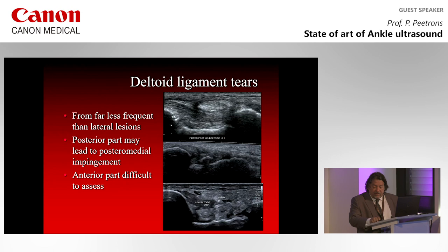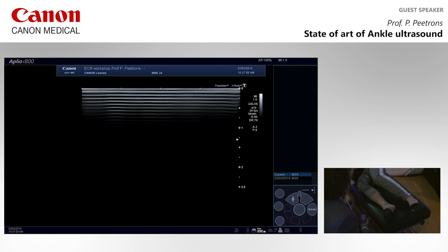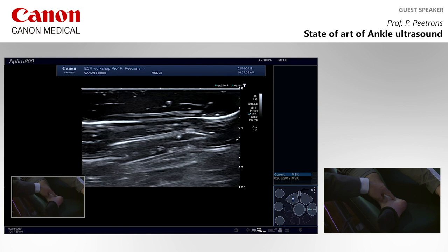So this is a little bit tricky. I will show you how to do it. Don't forget that all these ligaments are stressed in different positions. Turn on your right side. What is the stretching position for the posterior tibiotalar ligament? Do you know? You have to open the gate between the tibia and the talus. How to open the gate? Is it doing this or doing that?